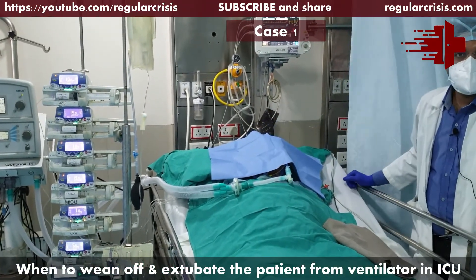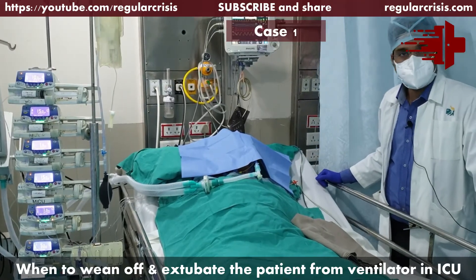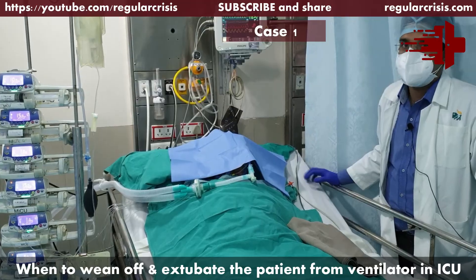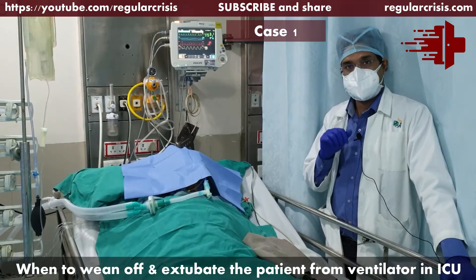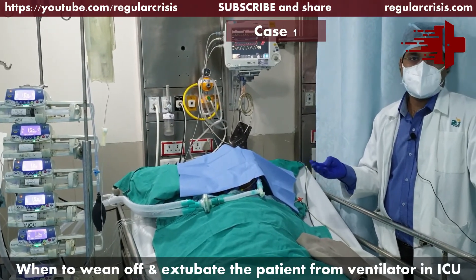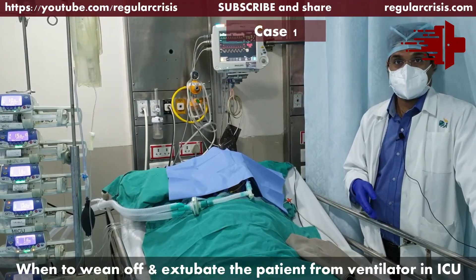As you can see, the patient is on multiple vasopressor supports — noradrenaline, adrenaline, and dopamine — at very high levels of 15 mls per hour each. So hemodynamic instability is present. Fourth, blood gas: PO2 is low and she is on 100% FiO2. Fifth, PCO2 is maintained and she is afebrile at the moment. So out of the six steps, she fails four: primary pathology, conscious level, hemodynamic stability, and blood gas/FiO2 levels. We are definitely not going to wean this patient.